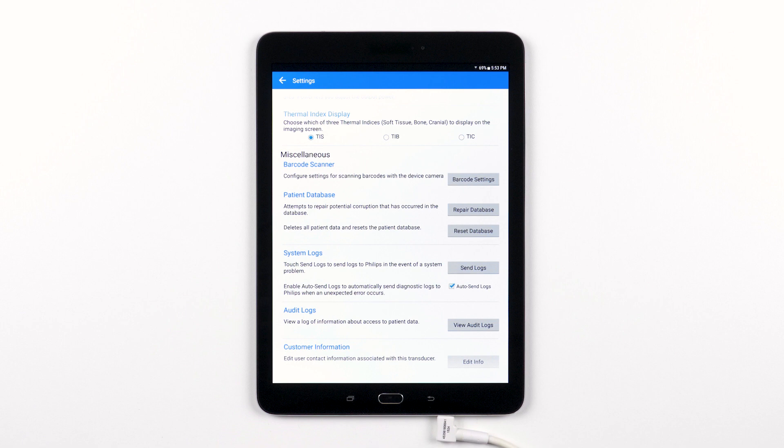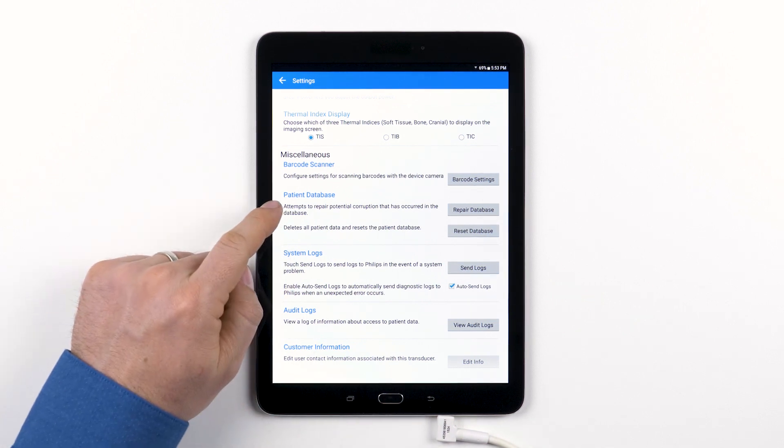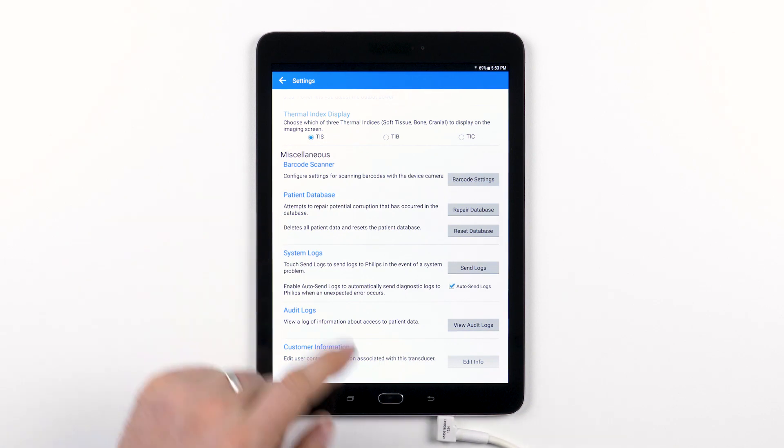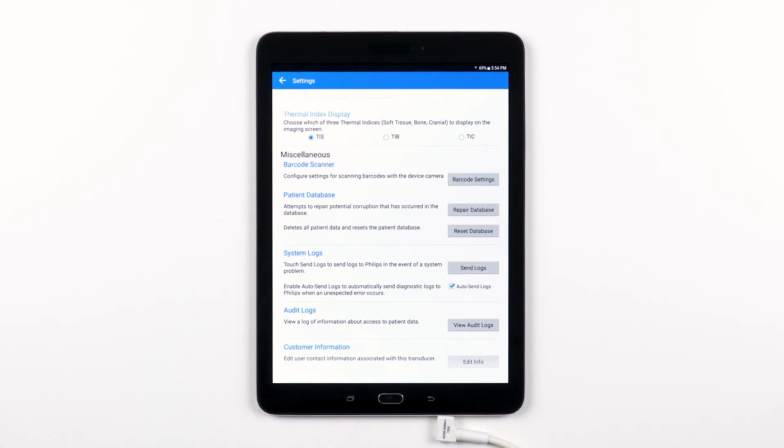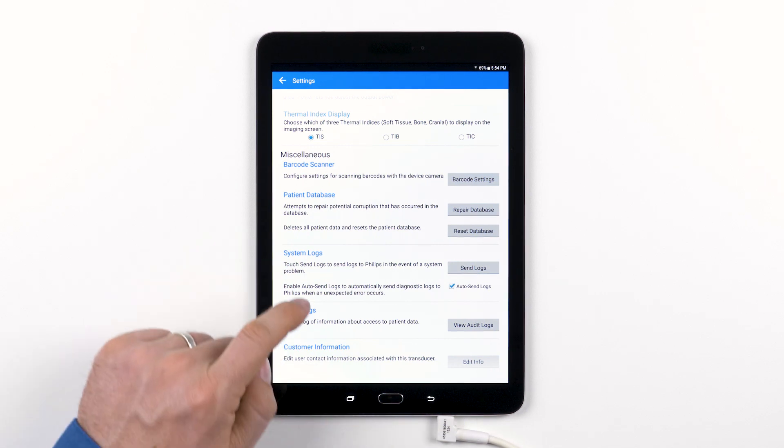In the unlikely event that the patient database gets corrupted for some reason, the patient database section is where you can repair or reset it. If you encounter a database problem and these steps don't take care of it, don't hesitate to get in touch with our Lumify service rep.